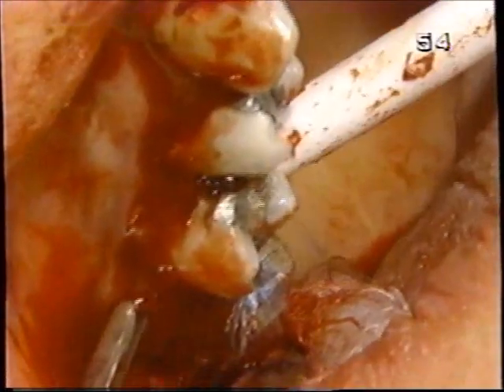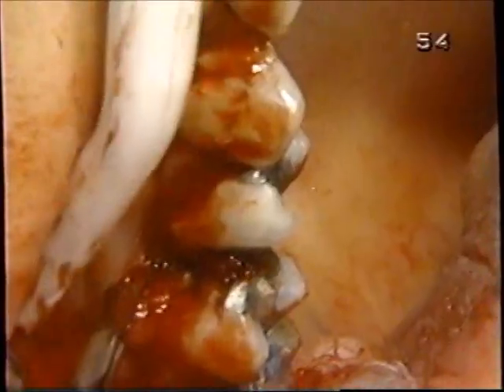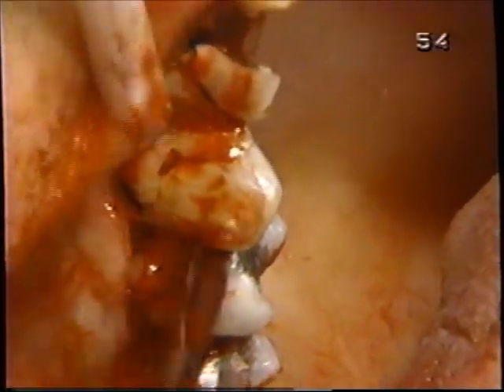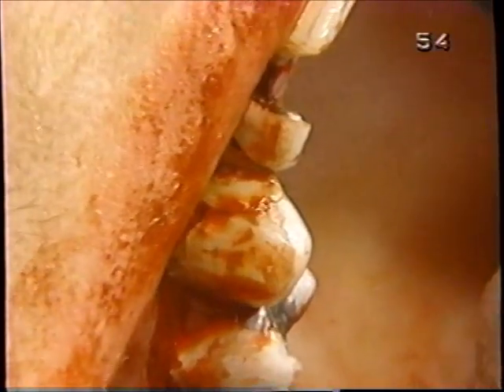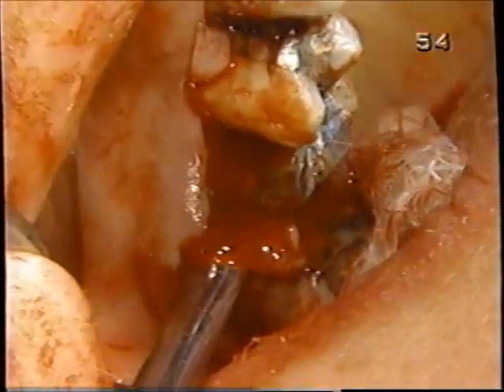If luxation is so important, whether it's done with a 301 or a forceps, or a 34S for that matter: expansion of bone, disruption of the ligament, loosening of the root, suction on the facial if you would, so that if a root does break, it's so much easier to get out if it's been luxated. Okay, now we're going to continue luxation, this time with a larger elevator.